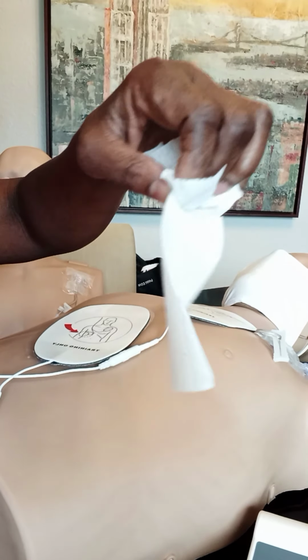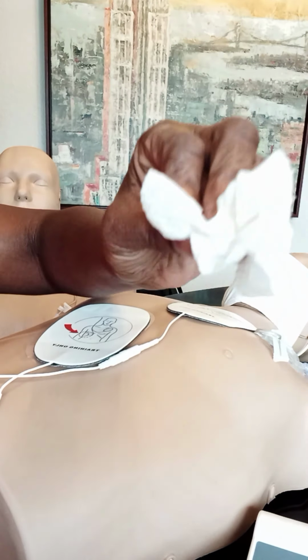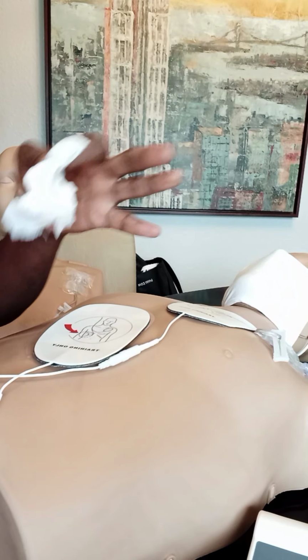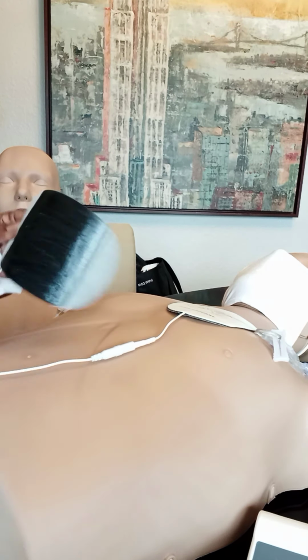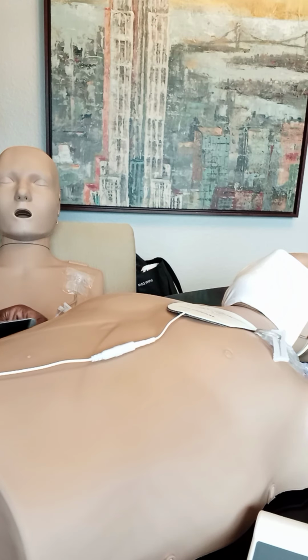Apply pads. I'm removing my medicine patch. Connector. You notice I used a napkin or a tissue. In the hospital, use a glove. Or if you run around with gloves in your car, use a glove. If you run up on a scene like this, you're going to apply the pad here.